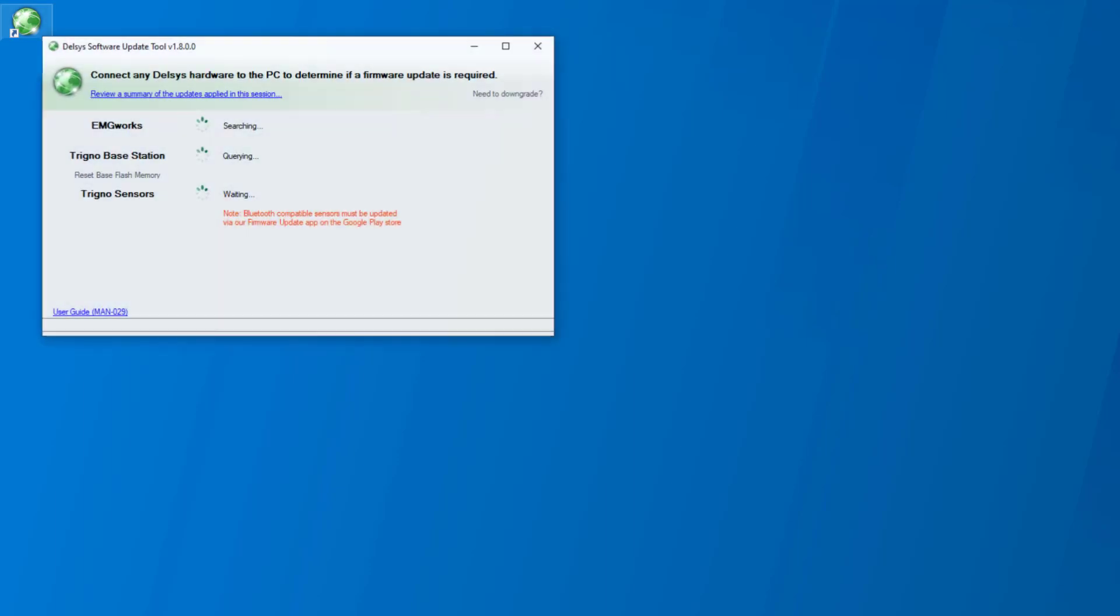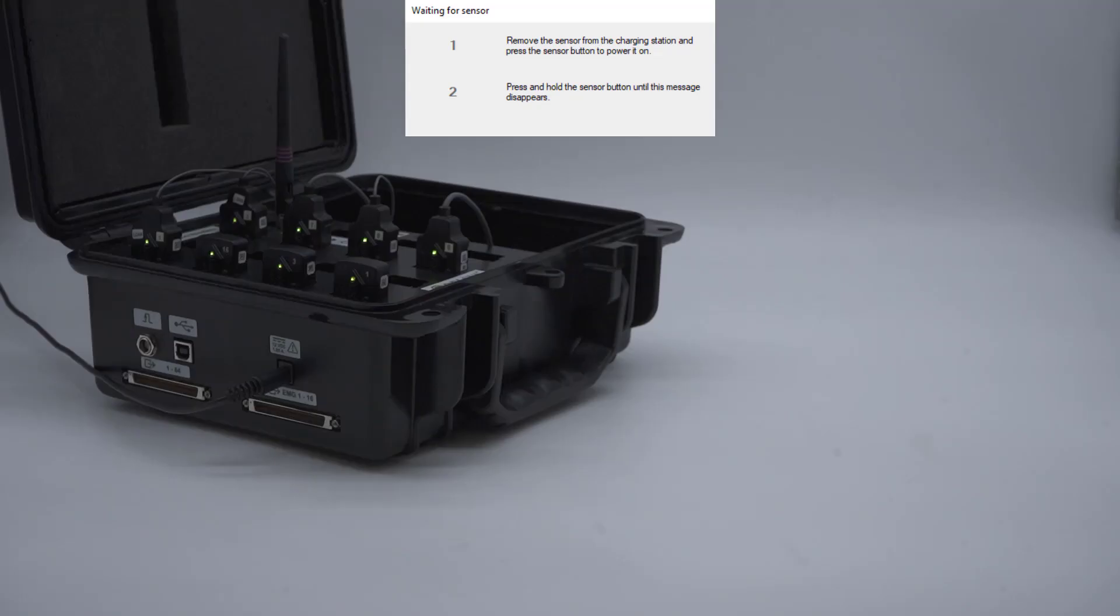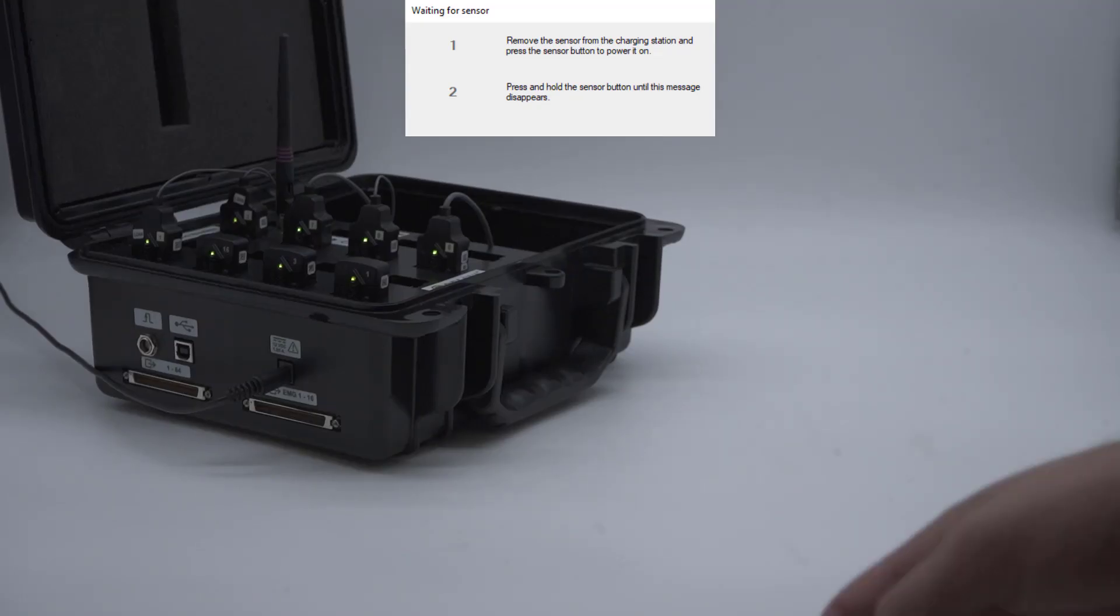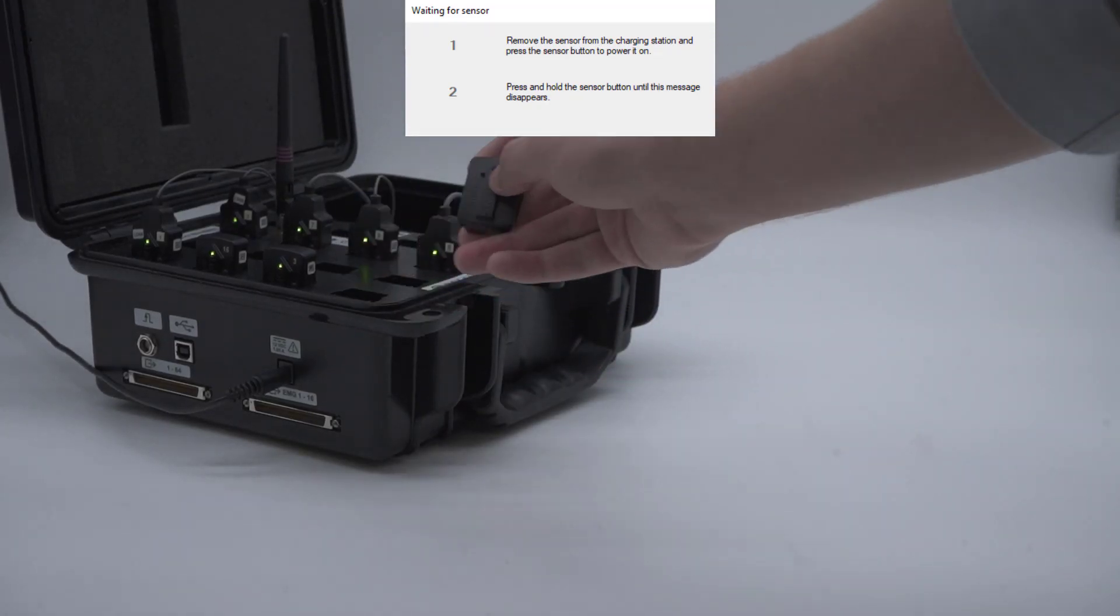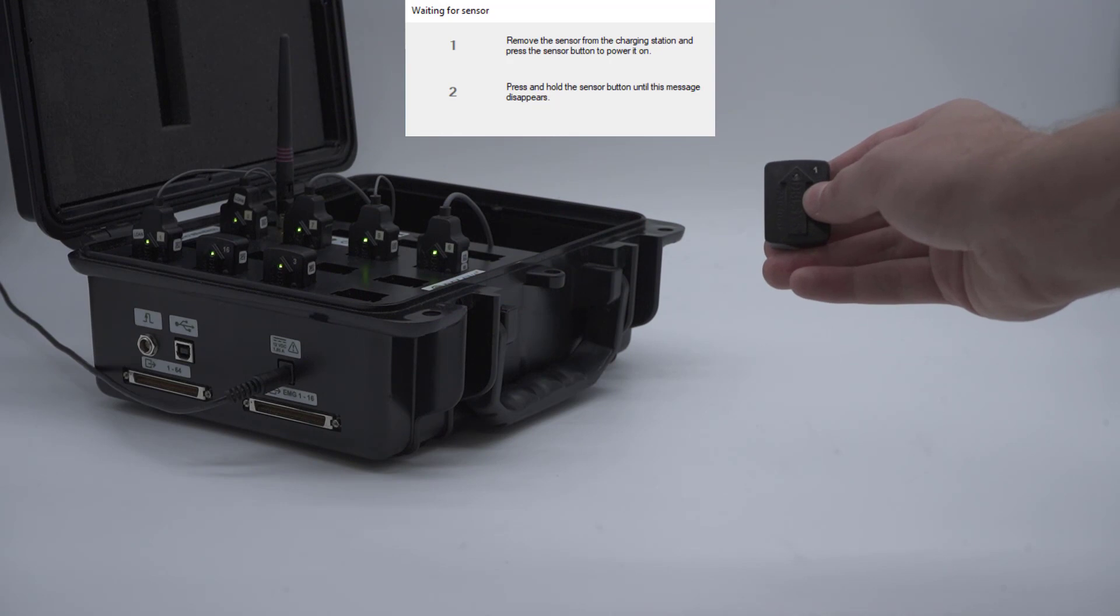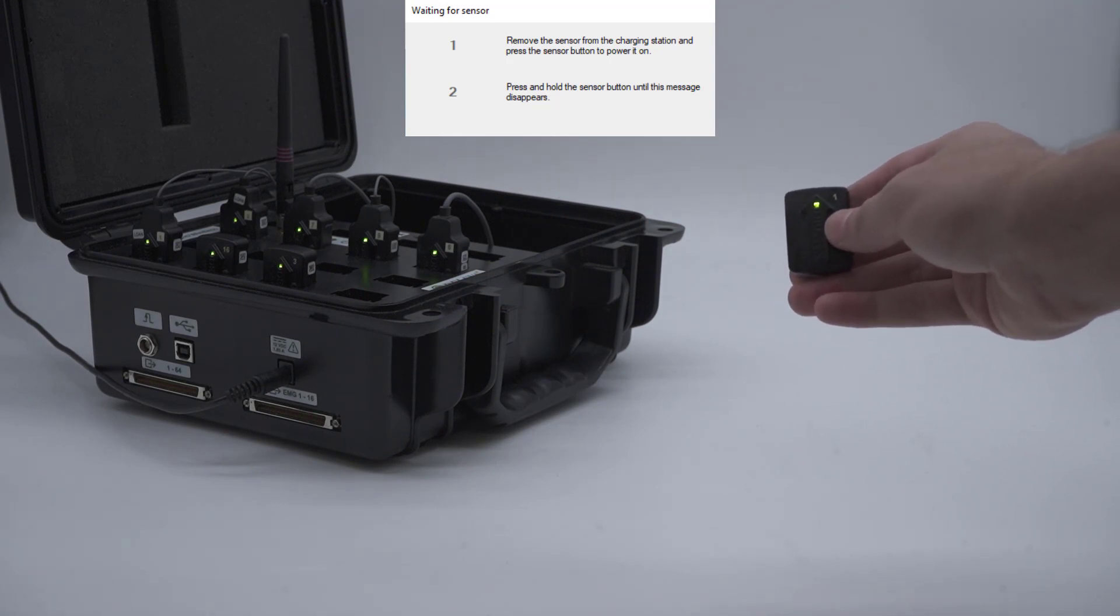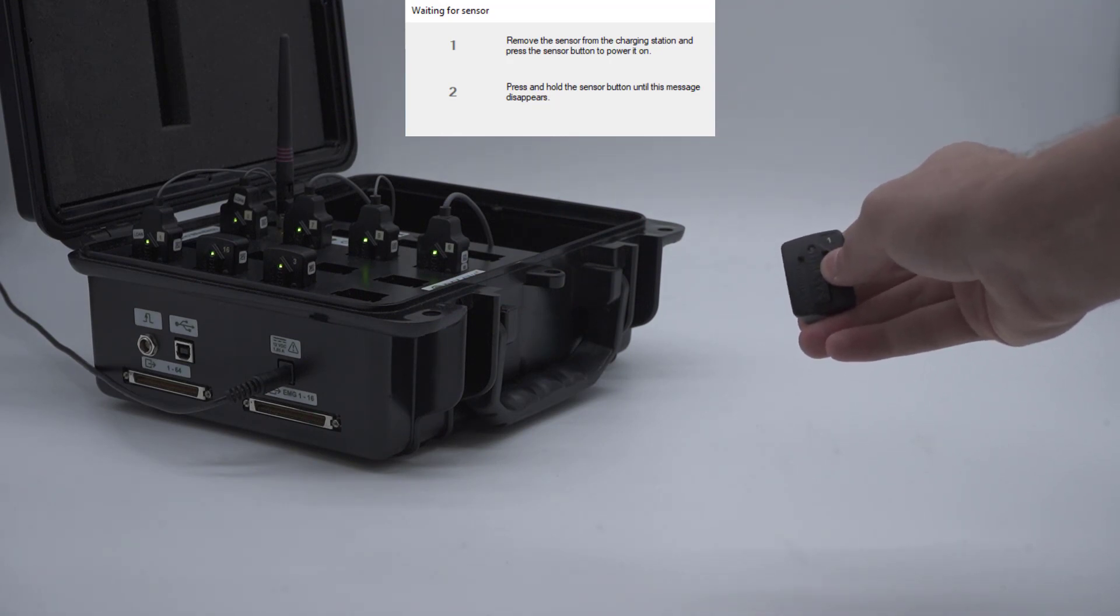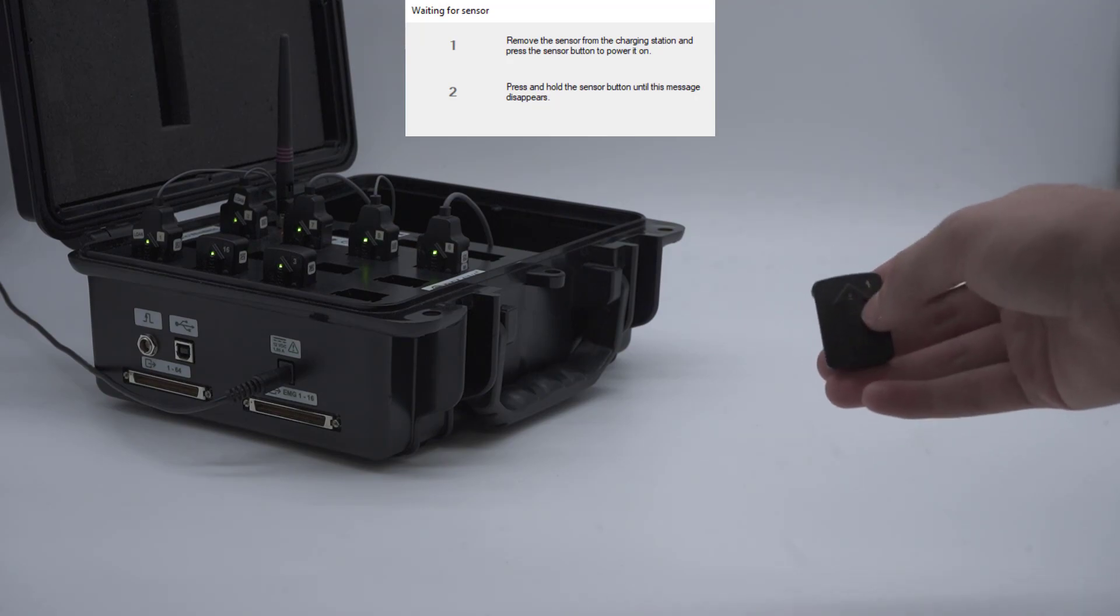To begin, open the Trigno system update tool. Click the pair/query sensor button. Undock one legacy style sensor from the base station and press the sensor button to turn it on. Wait a few seconds, then hold the sensor button down until the prompt disappears.